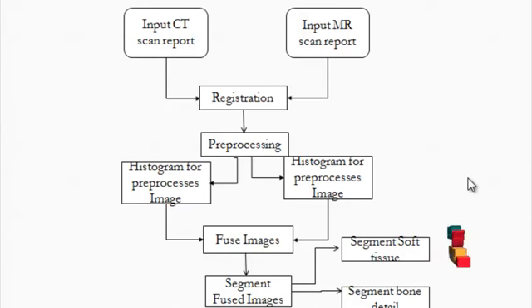After that, we perform the fusion process, which is done by FCM. FCM is used to segment and fuse the images. Basic fusion is performed on the CT and MRI images. The fused image is further used for segmentation. FCM segmentation segments the images. We give the cluster points as 2 to 3 cluster positions. The clustered segmentation images are displayed in a separate figure window.